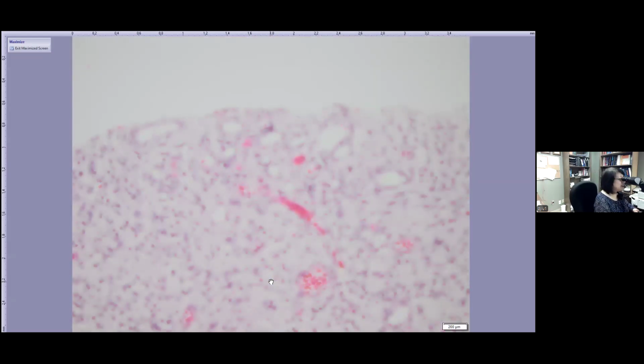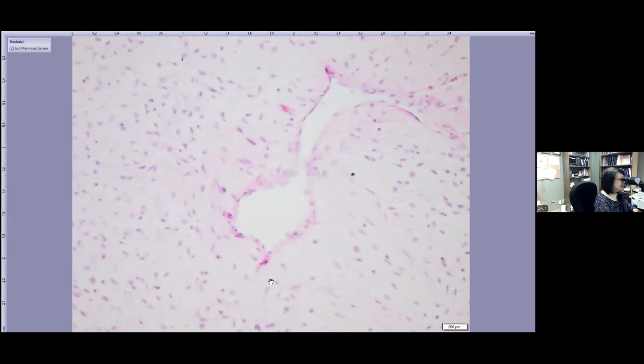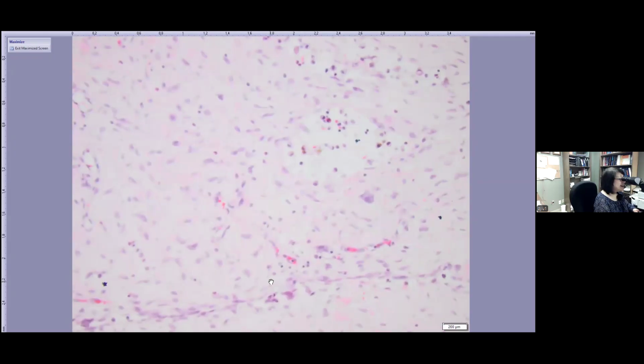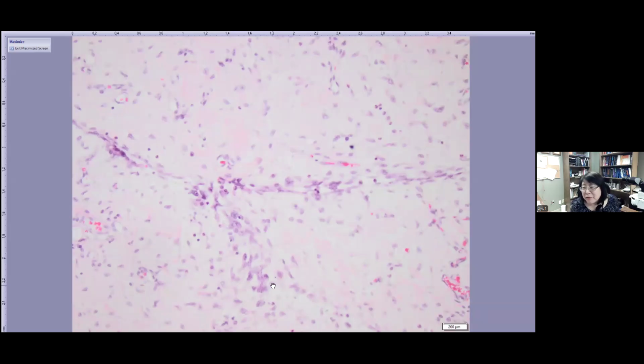It's a good thought, with inflammation and myofibroblastic proliferation, but something is related to the giant cell. Oh, there's another pseudocyst. So those giant cells, this is what we call giant cell fibroblastoma. Giant cell fibroblastoma is a variant of DFSP, dermatofibrosarcoma protuberans.